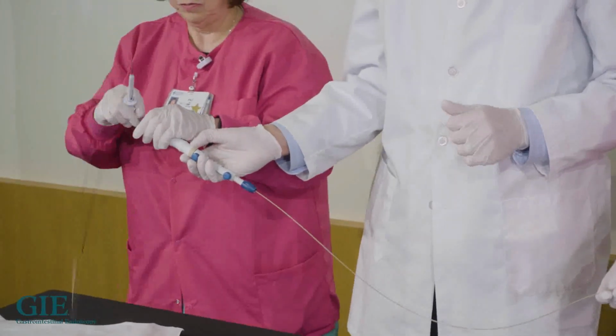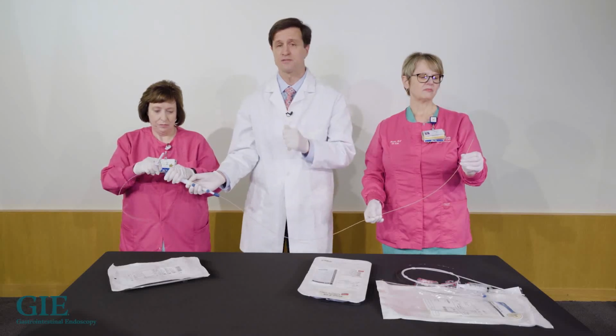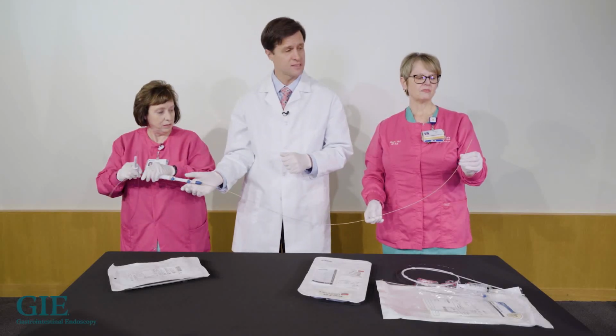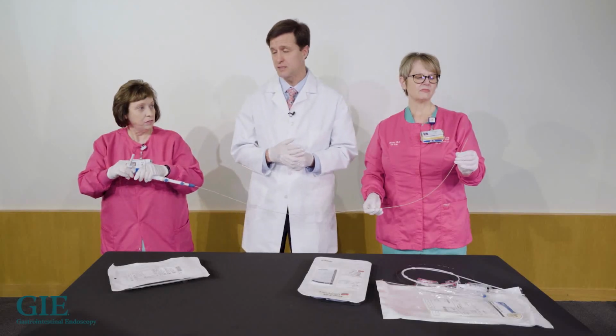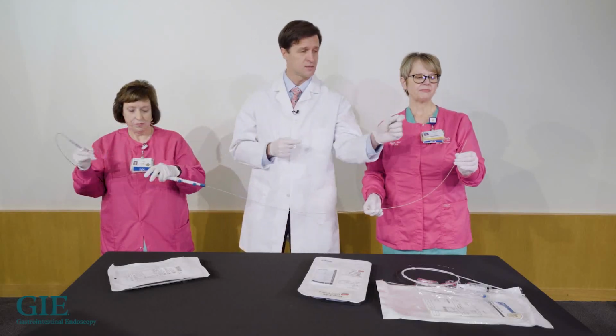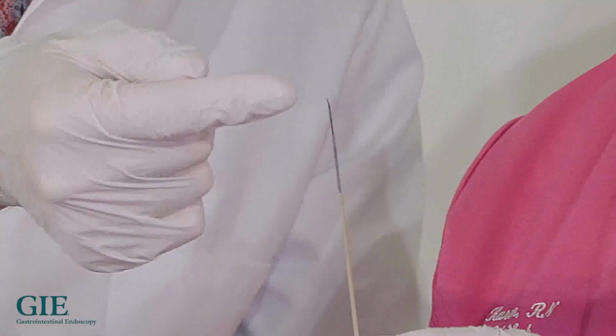Before you do this for the first time, hopefully you've done it many times in practice before you do it on a patient. Before you do this the first time, make sure you know the distance that the forceps are going to come out through the needle, because it's not all the way to the hub. So the forceps, as you can see here, are out now. Pat's going to open them. You can see the forceps open.